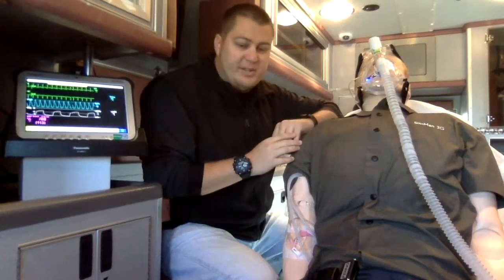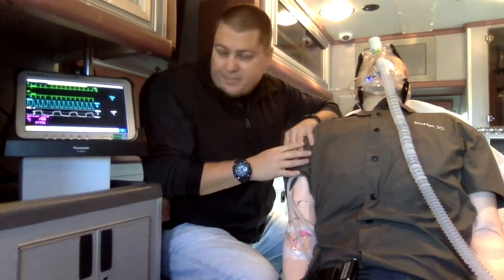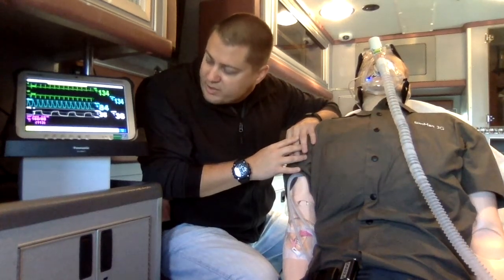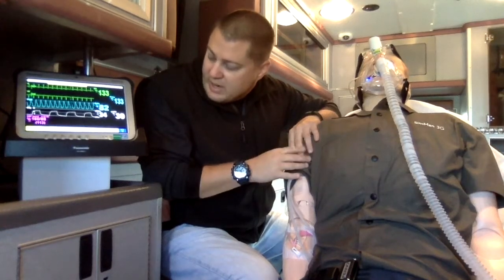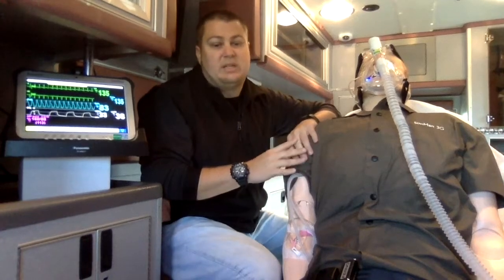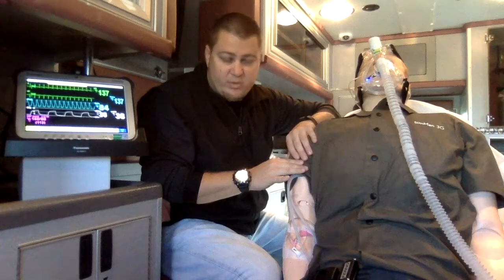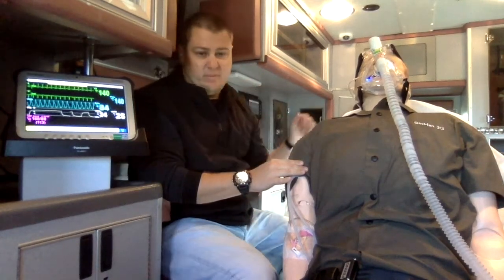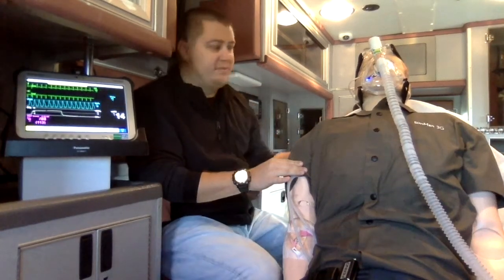Secondary exam, I have no additional findings. I notice with CPAP here at 7.5, I still have a waveform that tells me there's no airway restrictions. I do have a slight increase in end tidal values. I also have a decrease in respiratory rate with some increase in unresponsiveness. Patient will open his eyes when being communicated with, but will not follow any commands. Respirations went from in the 40s to about 8 a minute, so I have a suspicion of pending airway failure.